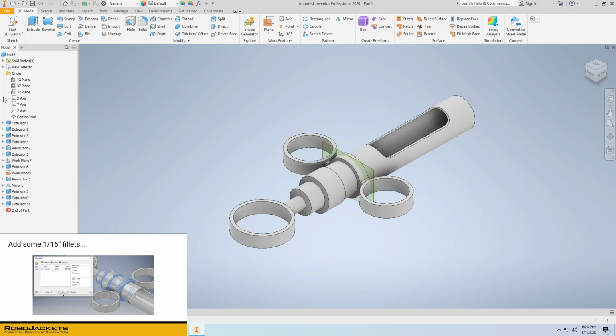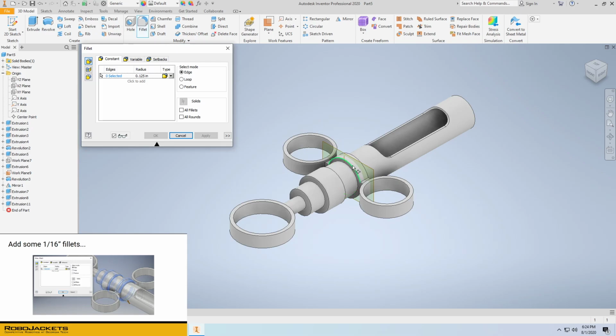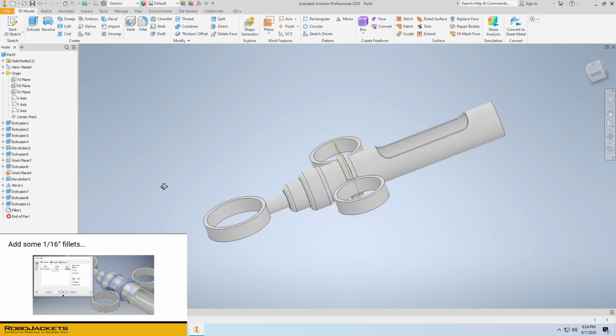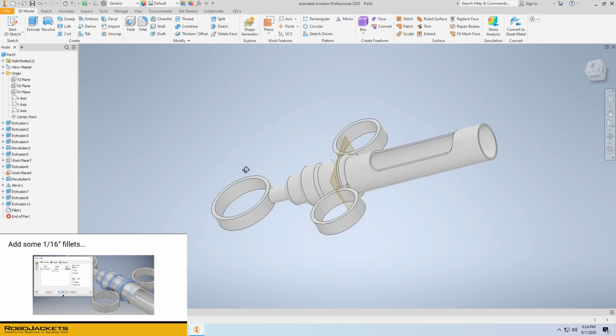We're going to add on some 16th inch fillets to make it look nice. So go ahead and select each geometry you'd like a fillet on. There we go. Radius 1/16. And we'll hit OK on that. And here's our syringe, or at least the holder for it.